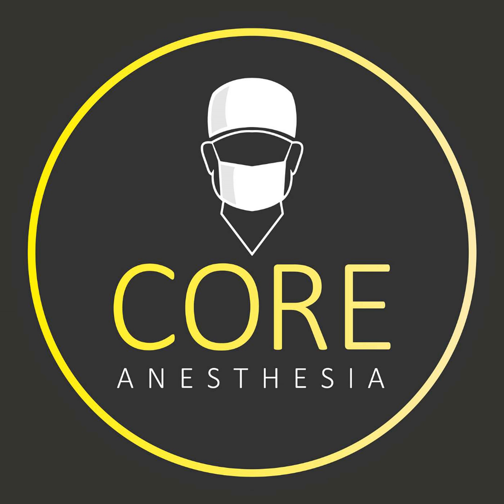And then just very briefly, these are not all of them, but there's a couple different variations of ET tubes. You can have an evac tube. It allows a second lumen for you to do subglottic suctioning through. This is very nice if you have a patient that's going to be going to the ICU and remain intubated for a while. They can continue to suction the patient there. You can also do microlaryngeal tubes. These are pediatric size diameter tubes, but they have an adult length. So they're small enough to move side to side in the trachea if you have any airway surgeries. Because typically if you would use a smaller diameter pediatric tube, you would not have the length to reach the adult larynx. So that's why these are very beneficial.